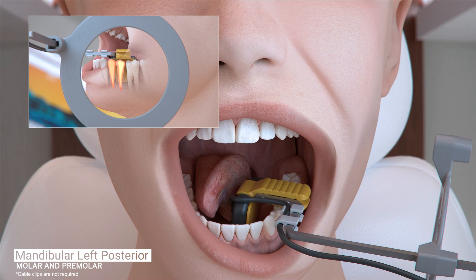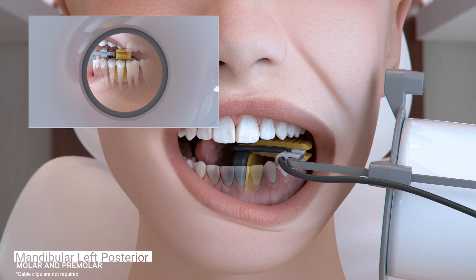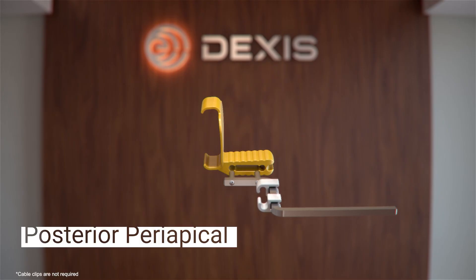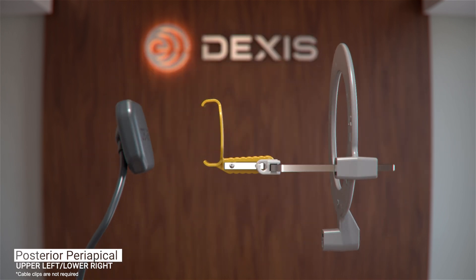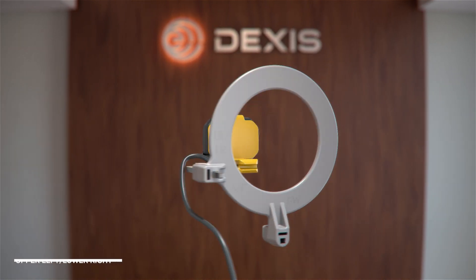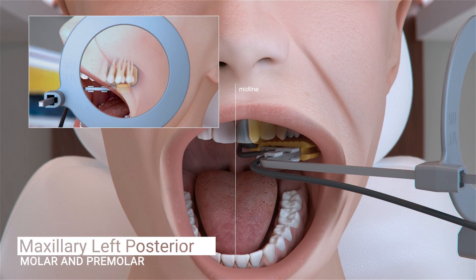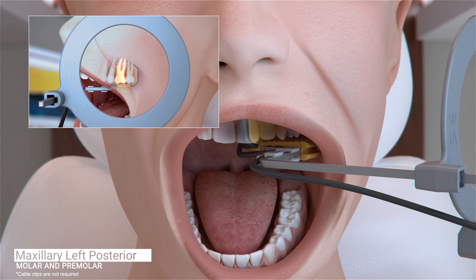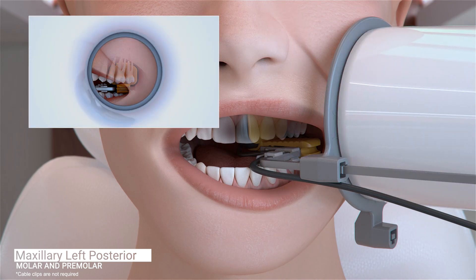The image should contain the distal of the canine through the mesial of the second molar. The configuration of the sensor and holder will change for the next set of images in our series, the maxillary left periapicals. Position the sensor in the patient's mouth toward the midline of the palate, parallel to the roots of the molar, and centered on the first molar. Ask the patient to close and slide the aiming ring as close to the patient's cheek as possible.